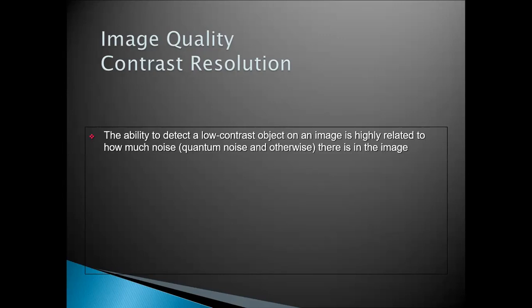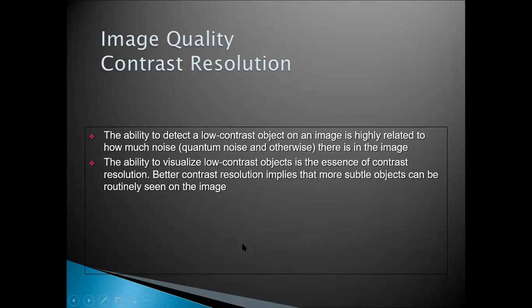That is why, if you want to increase the contrast resolution, you increase the exposure rate. Increasing the exposure rate means one is using many more photons in acquiring the image, and what that means is there will be less statistical variation in the number of photons used. That otherwise means we have a high SNR, signal to noise ratio, or even CNR, contrast to noise ratio.